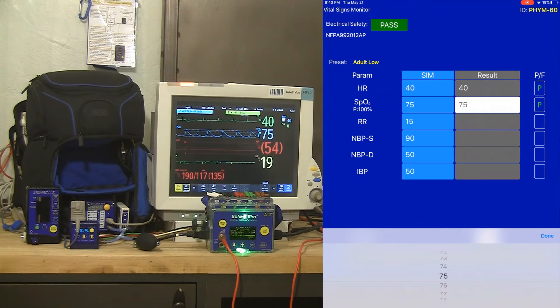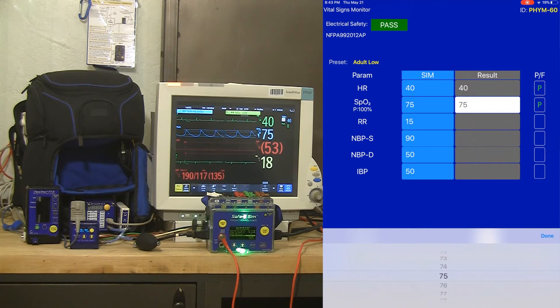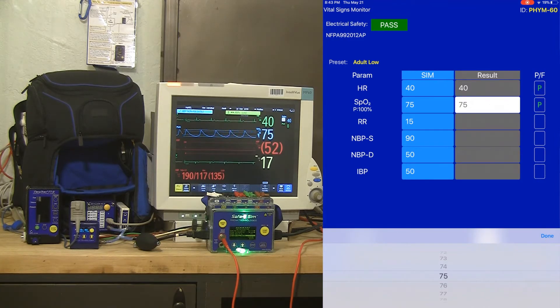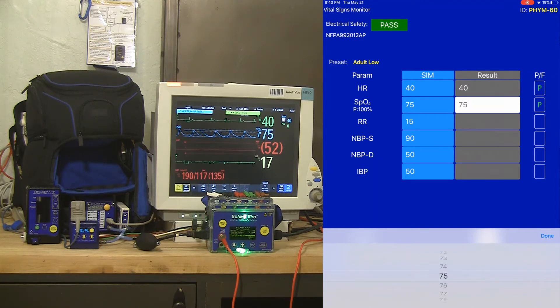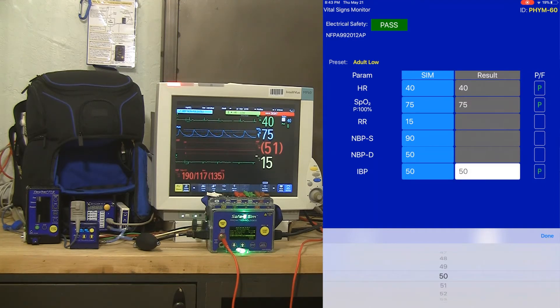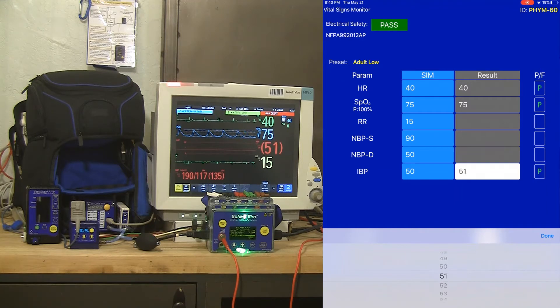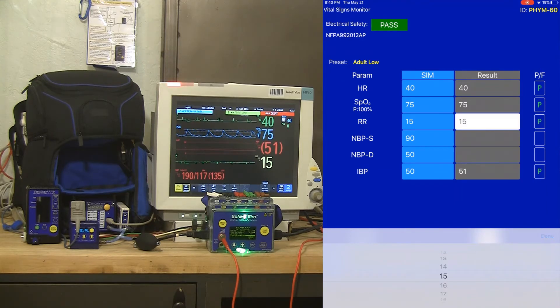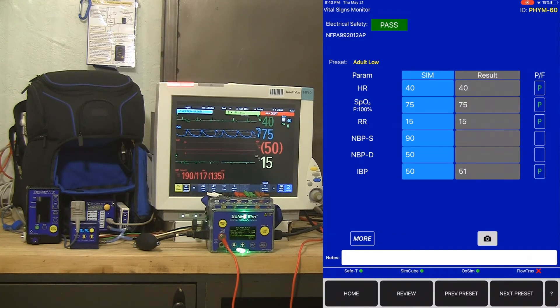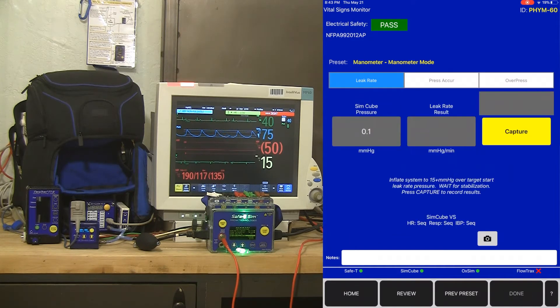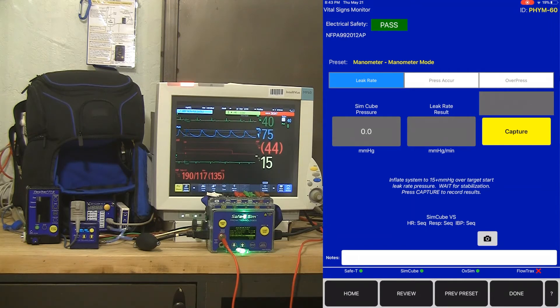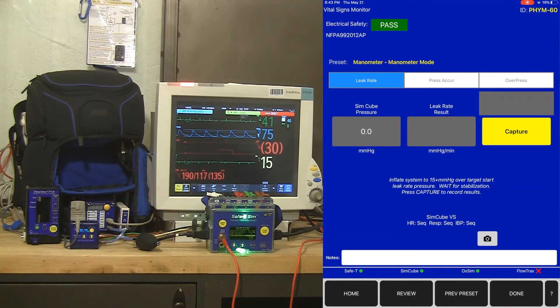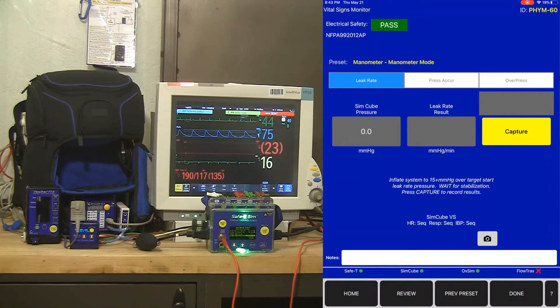My resp rate of 15 will take a little bit of time, and so will the IBP. So just a reminder, you can change the simulated value on the left-hand side. You can easily get a result in, but you don't have to. You can just tap on the pass fail button. And IBP is now at 51, which is a pass and my resp rate is at 15. So I'm done with a low, mid and high simulation for all my vital signs parameters and I've moved into the manometer modes for testing the NIBP circuitry.